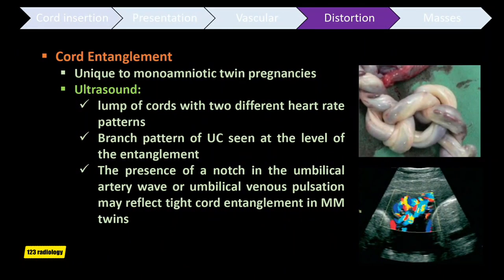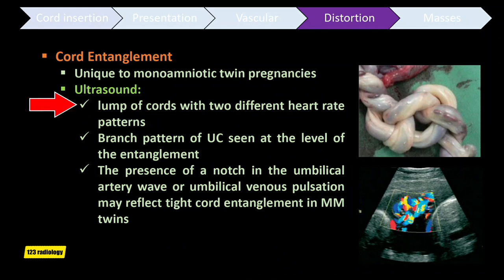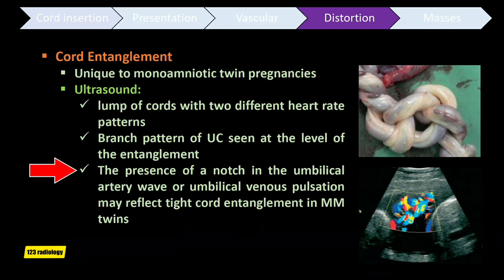Cord entanglement is a classic feature of monoamniotic twin pregnancies. It can be diagnosed by 2D ultrasound, color, and pulse Doppler. On ultrasound, a lump of cords with two different heart rate patterns can be found. A branching pattern of the umbilical cord is seen at the level of entanglement. A notch in the umbilical artery wave or umbilical venous pulsation may reflect tight cord entanglement in monochorionic monoamniotic twins.